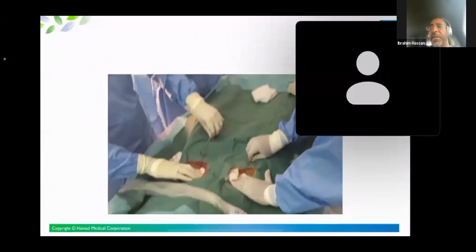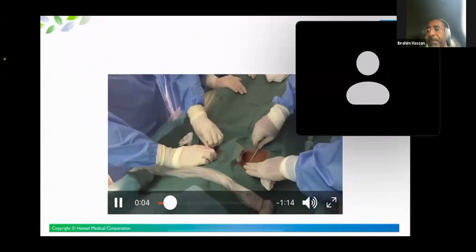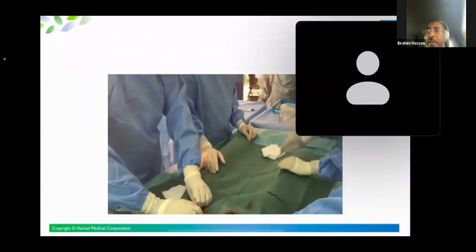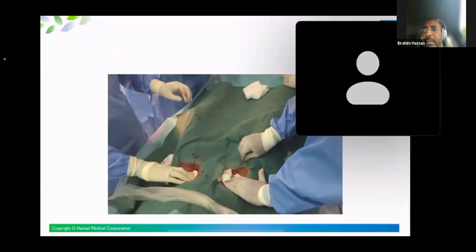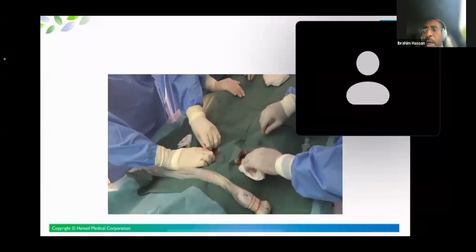I thought I'd show a video of how we do a femoral cannulation in a trauma patient, because with polytrauma and bleeding, people worry about the risk of bleeding. Although it's not that difficult. In this particular patient, we have no cut at all. It's just a needle over a guide wire, and then we do stepwise dilatation from 6 French, as you can see, going up to 8, 10, 12. Stiff guide wires are used, and we continue to do dilatation.